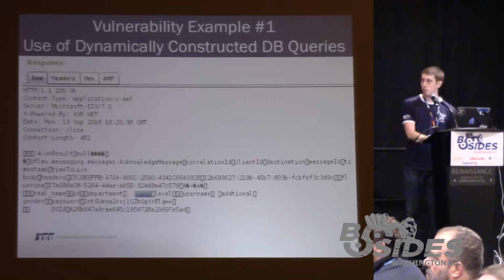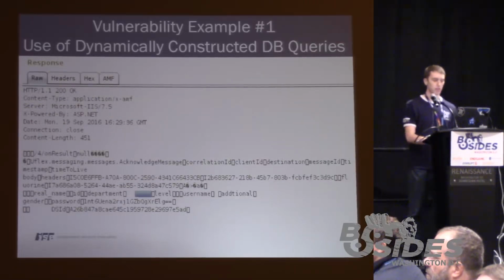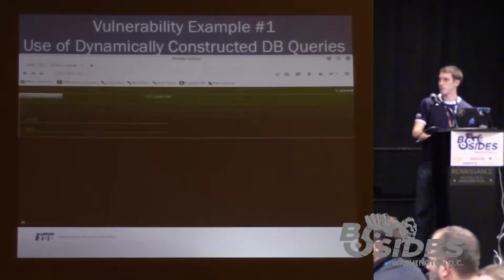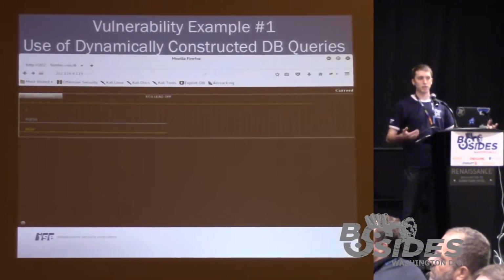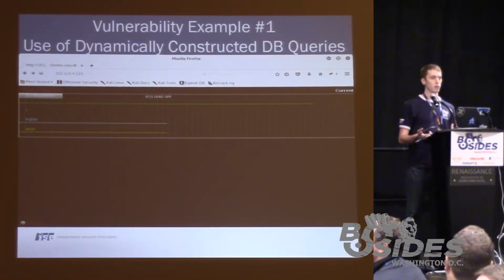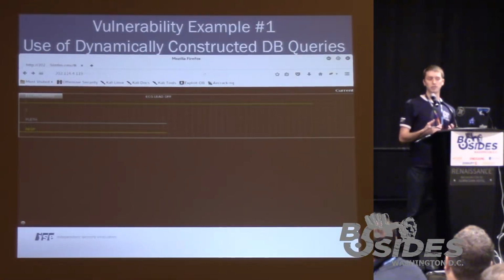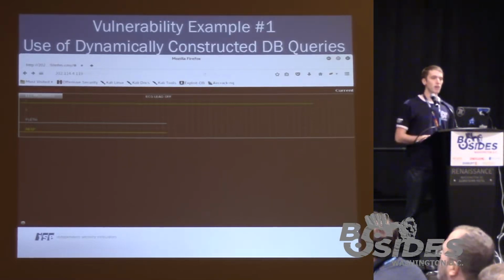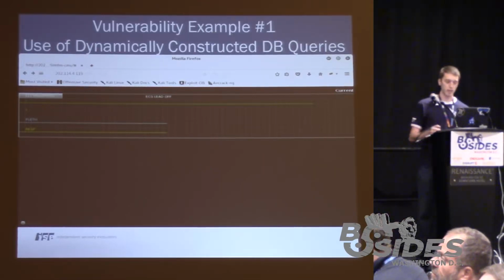When that was sent to the server, we're given this magical response that is different than what we saw when we were unable to log in. So that's kind of interesting. As soon as our browser receives this response, we're presented with this lovely page, and we're essentially able to bypass authentication by injecting a very trivial payload. So the very common example of SQL injection that you may have learned about when you were first curious about what SQL injection is exists in a medical device that is used within a hospital. So it kind of shows you the state of security of these devices. It's fairly weak.